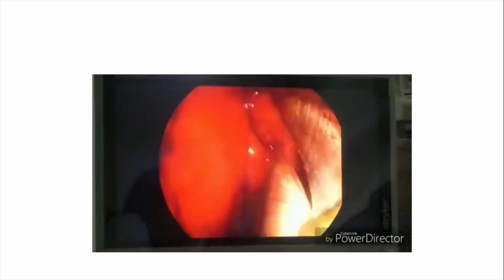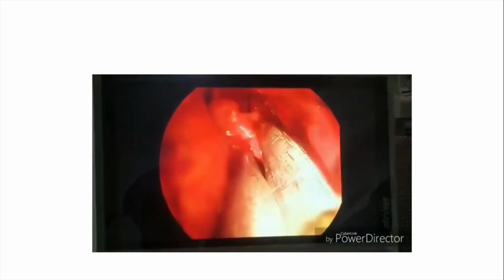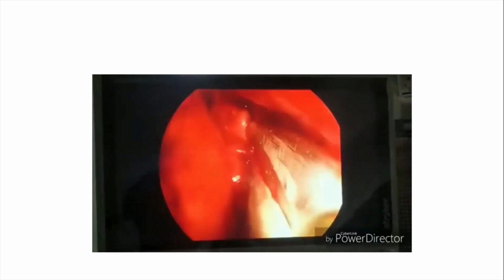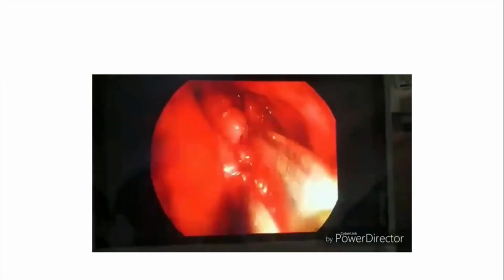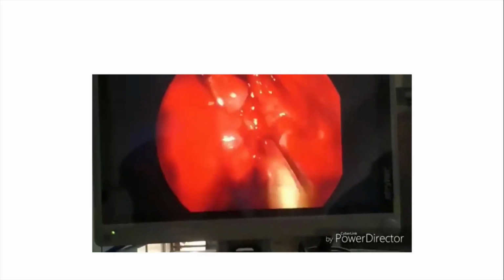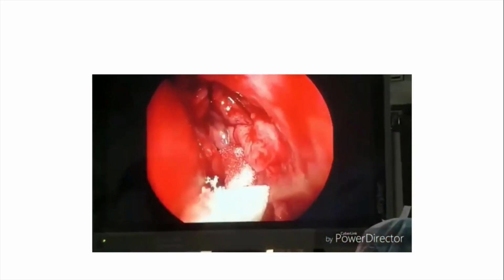After emptying the sac, superior and inferior flaps are marsupialized. See how the flap is blue. There is no flap. Previously they preserved the flap, now they removed it completely. The flap is being cut. Now, endoscopically post-operatively, straight away you can see the lacrimal part alone. You don't see any mucosal area alone.